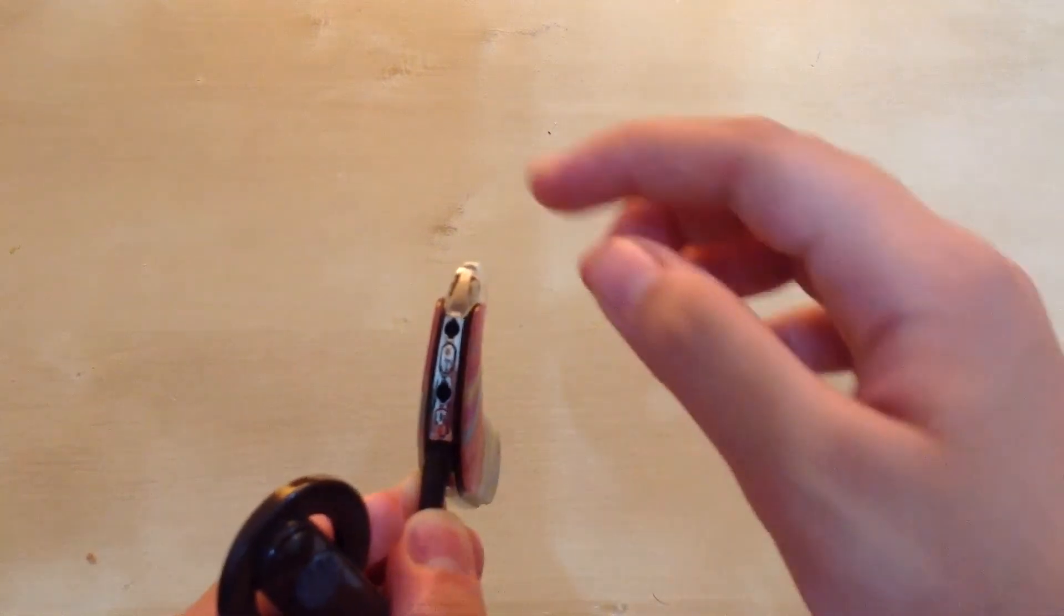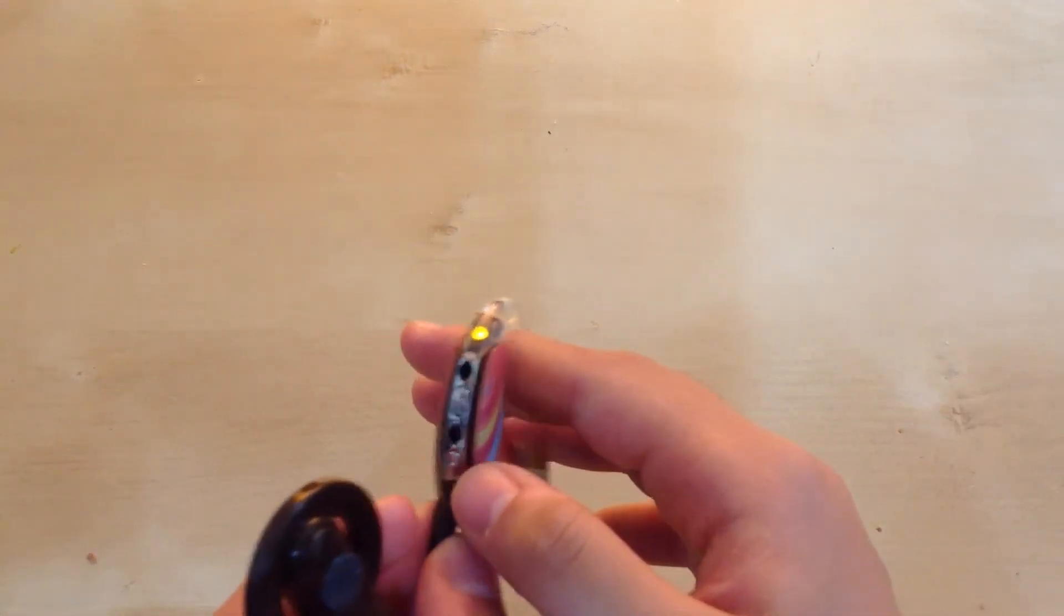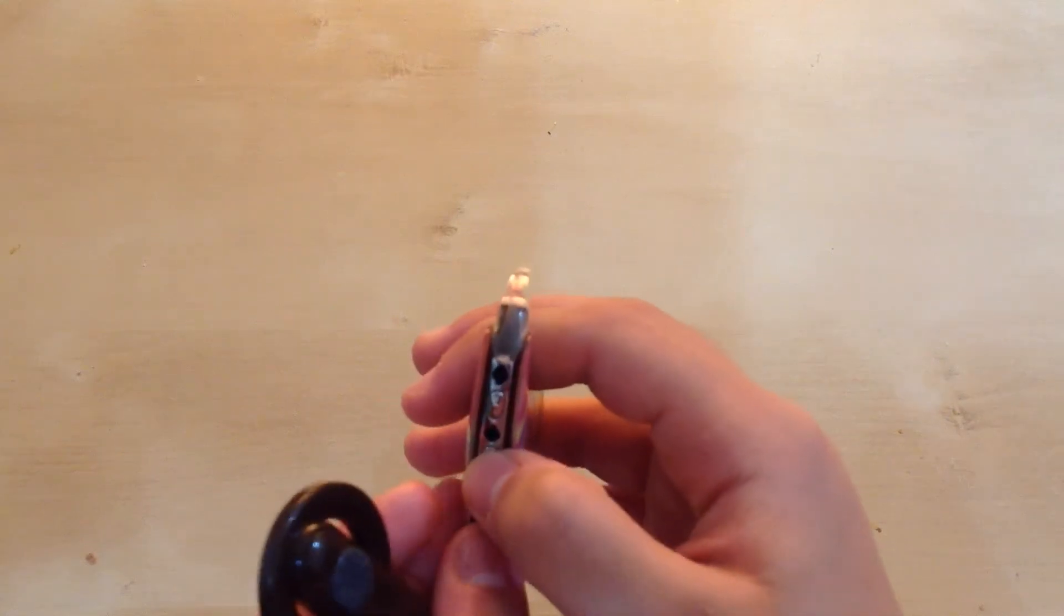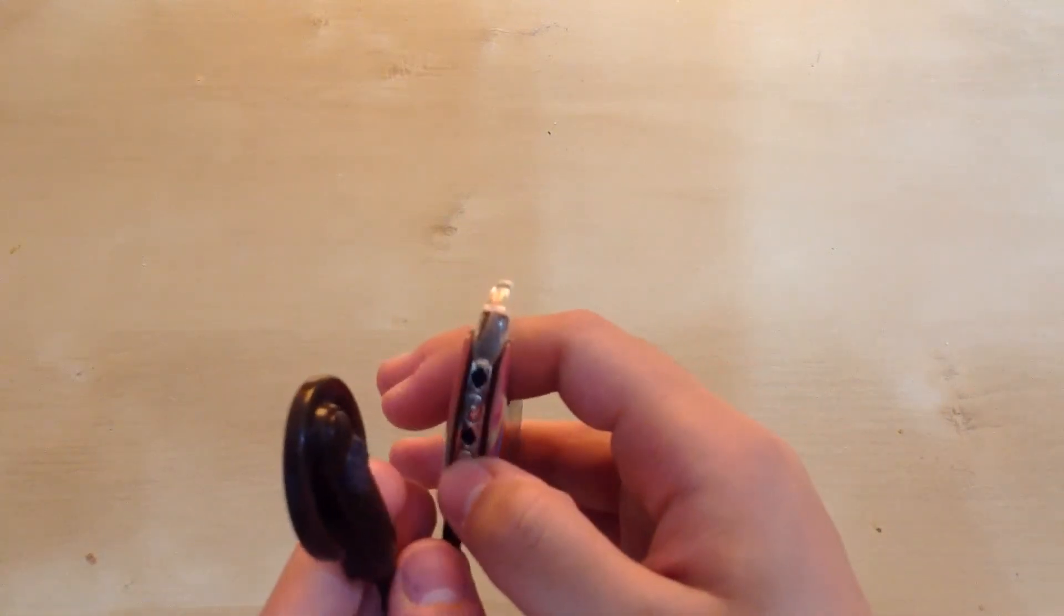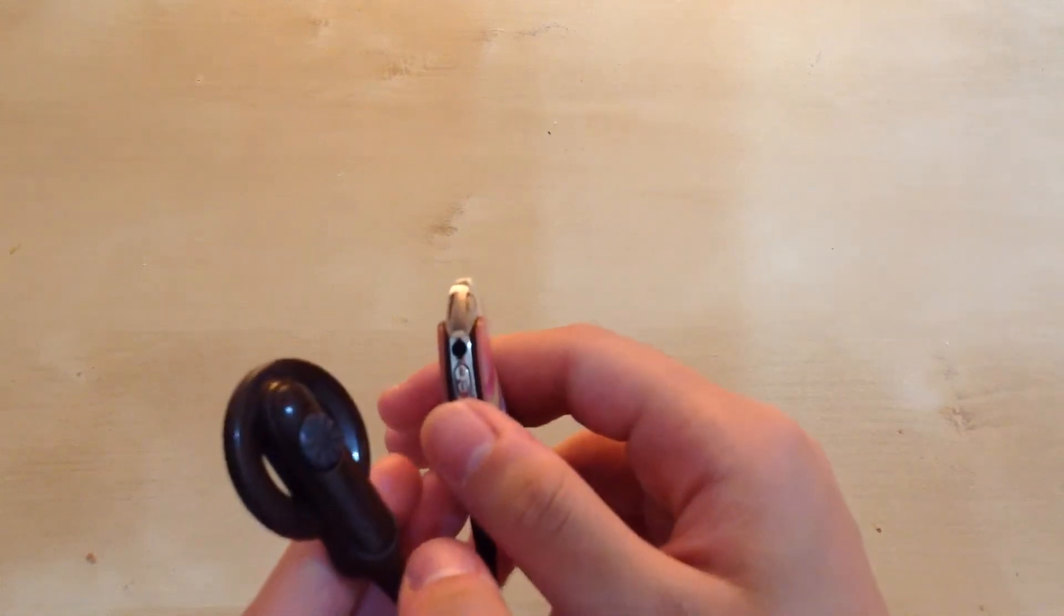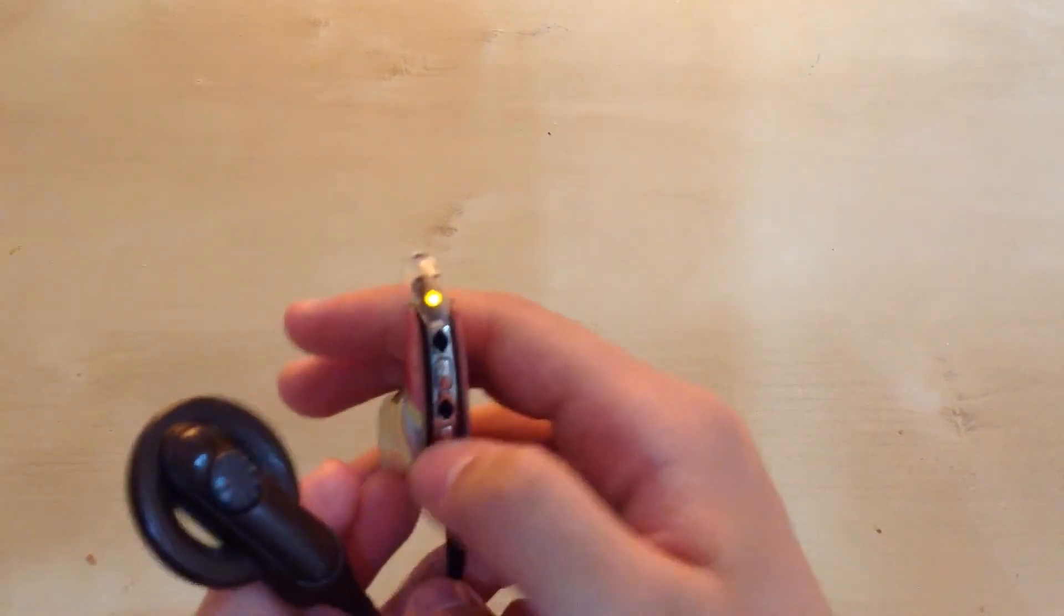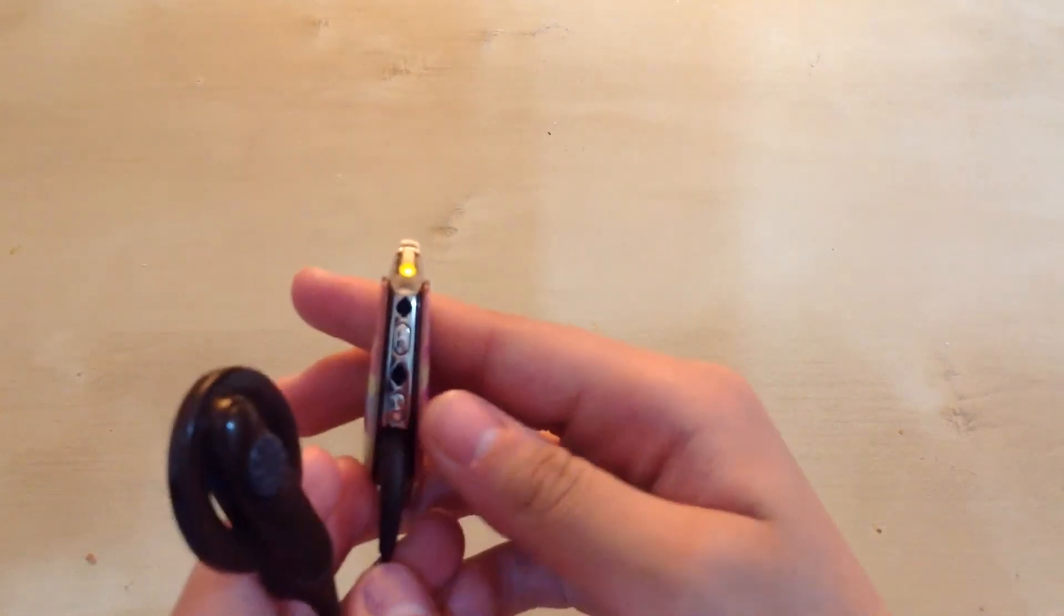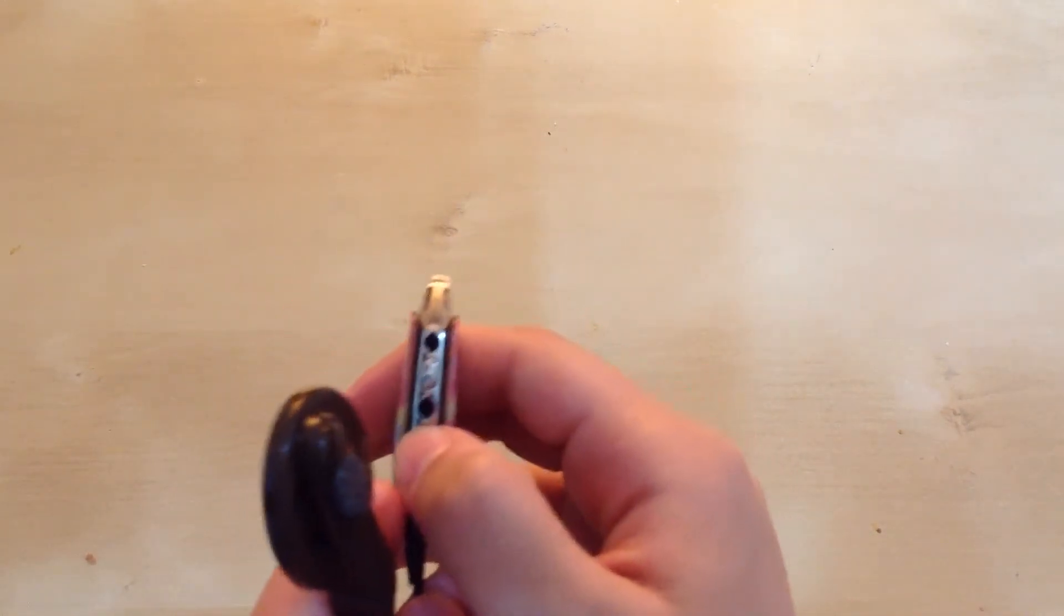You wait until you see the blinking green lights for your program. I'm just going to turn it back on to program one because that's the one that I use. There, that was one green light, which means it's on program one. Now to turn it off, I'm going to press this bottom button down for three seconds.